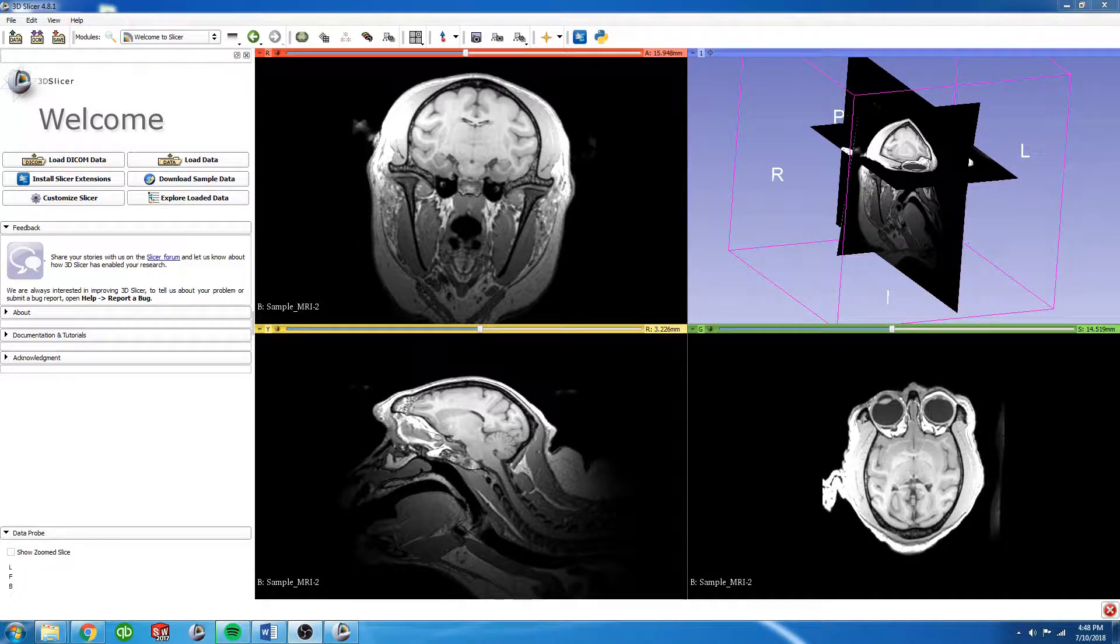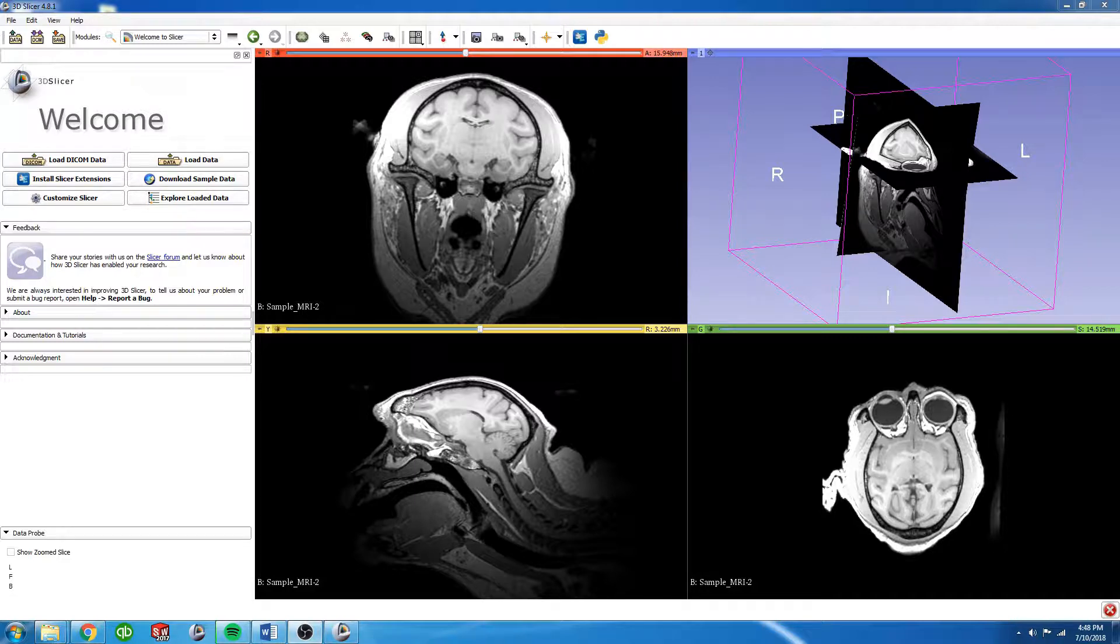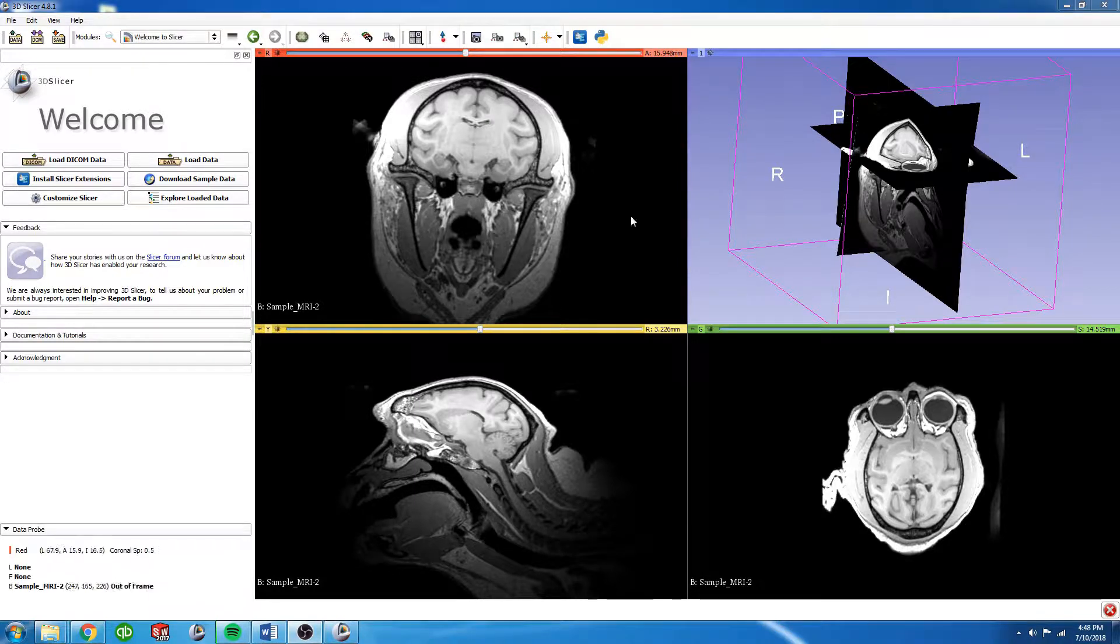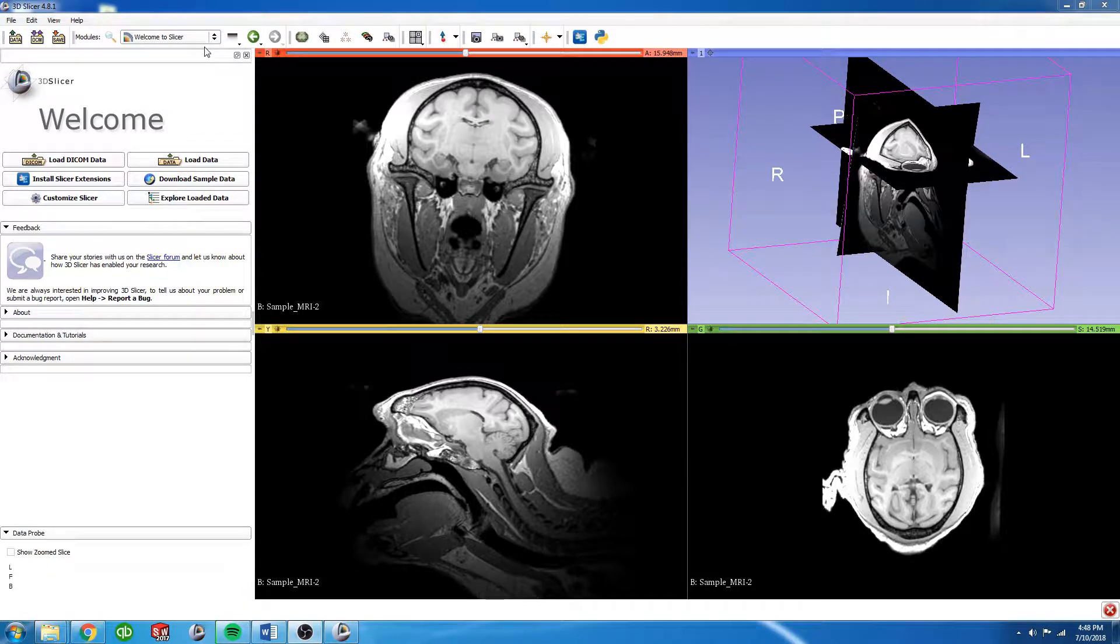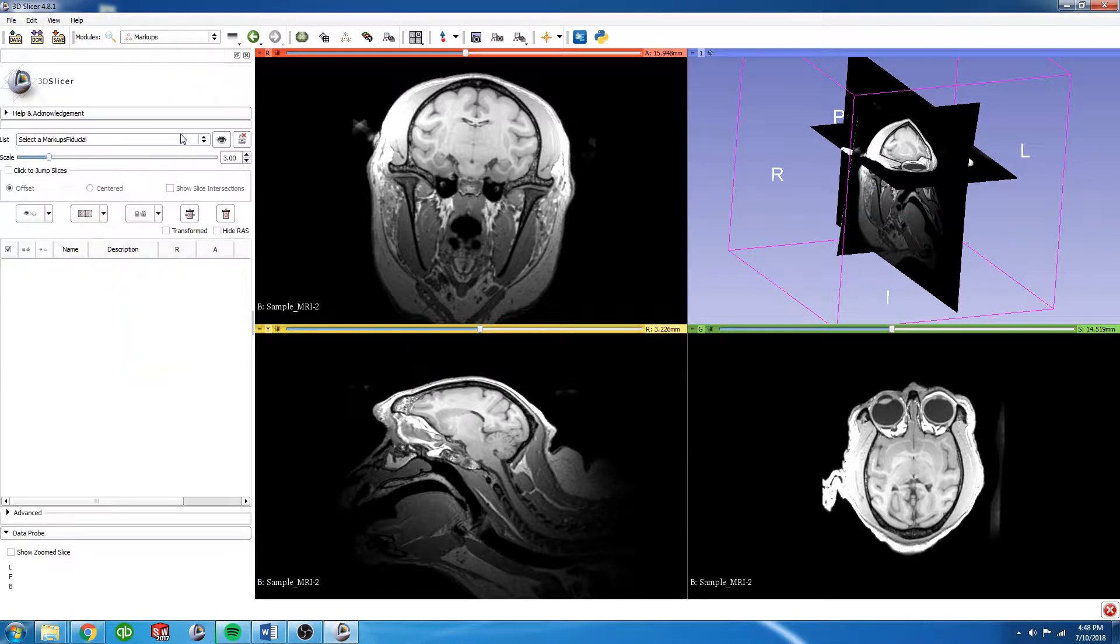In this video we're going to stereotaxically align our MRI. To do that we're going to use a new module called the markups module, and you can find that in the all modules dropdown markups.